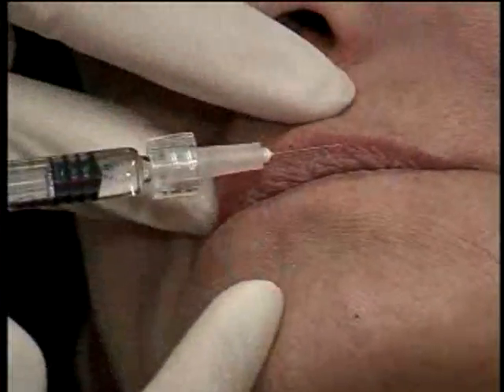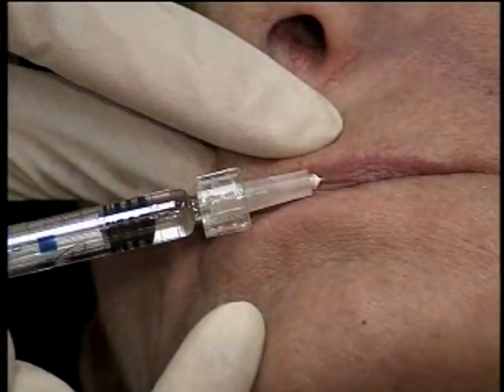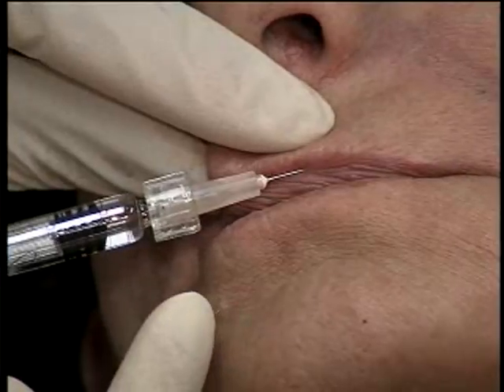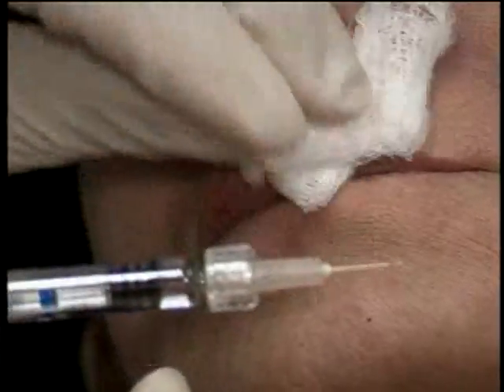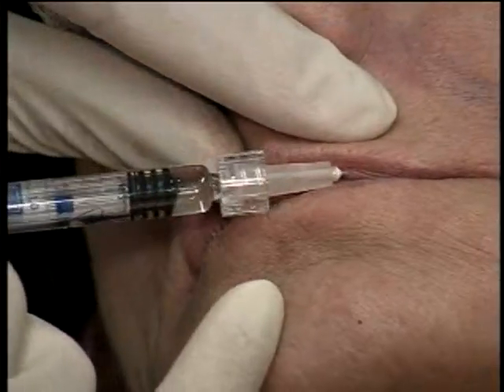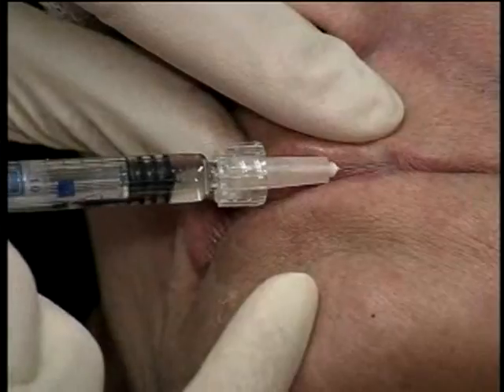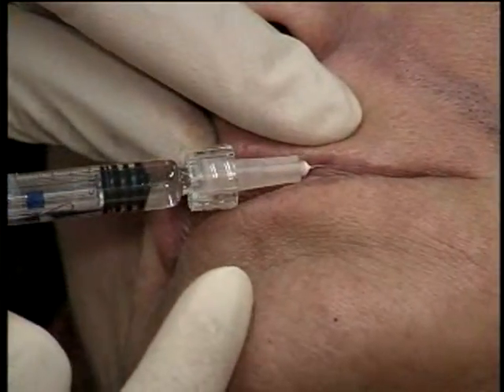Nice, slow, purposely. You don't want to inject too much. You have to be consistent with your pressure on the plunger, or else you may get little lumps. And Restylane is less forgiving in this area. So you want to make sure that you do it nicely and you don't miss any areas.